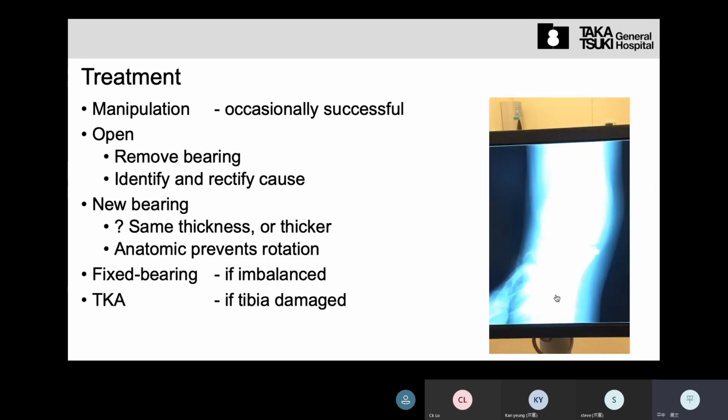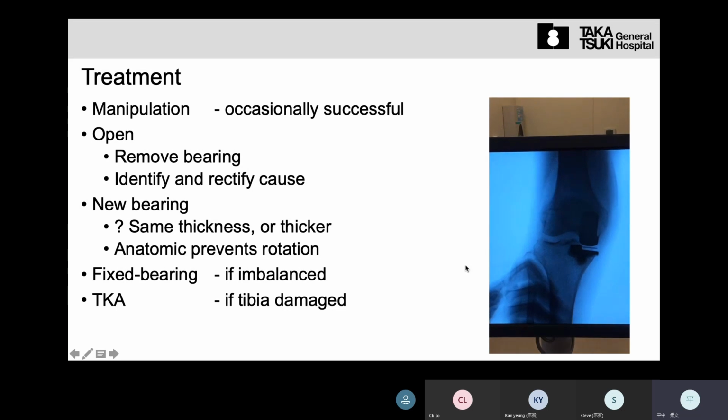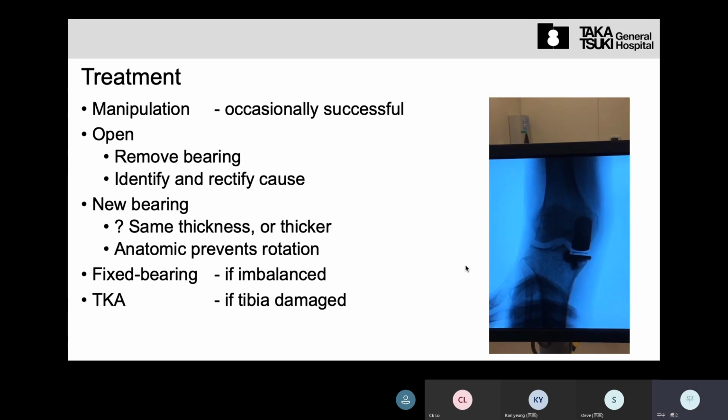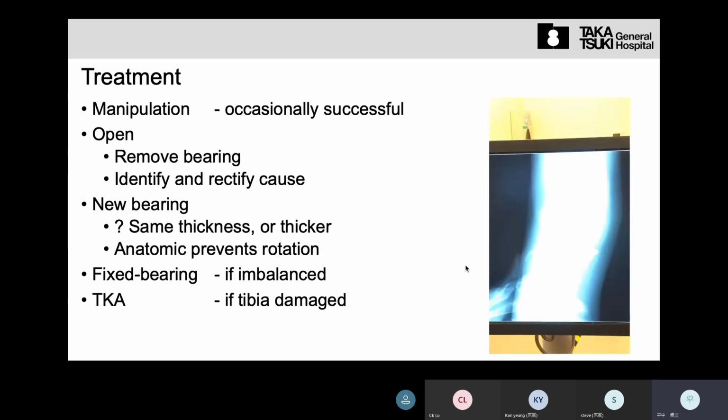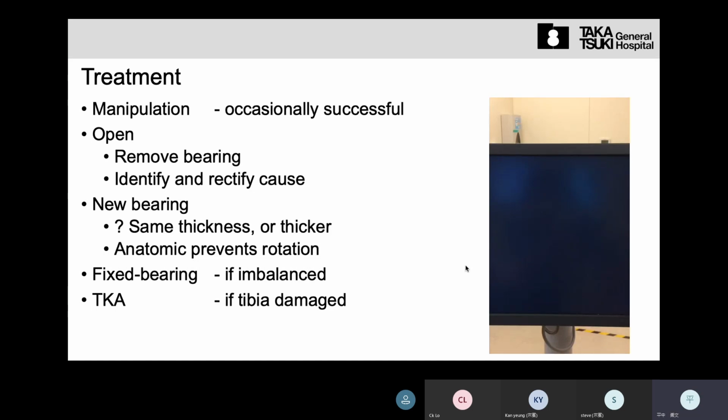Sometimes there is a big osteophyte or remnant meniscus on the posterior side. In this case, you should remove them and then change to a new bearing. Never use the same bearing, because after the dislocation, the polyethylene is damaged more or less. So please change it. Use the same thickness or 1 millimeter thicker. But if it is impossible to adjust the balance, we need to use the fixed bearing or change to a total knee.